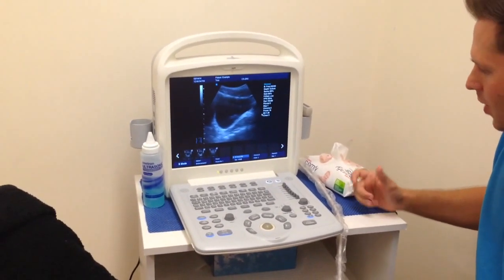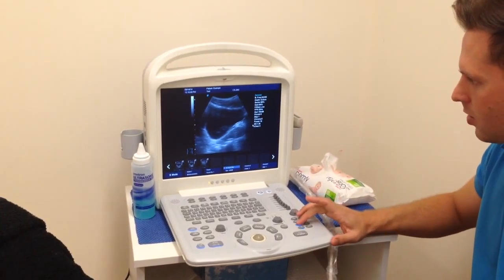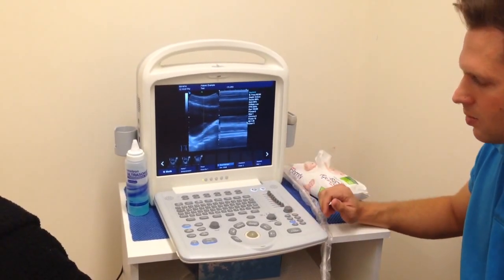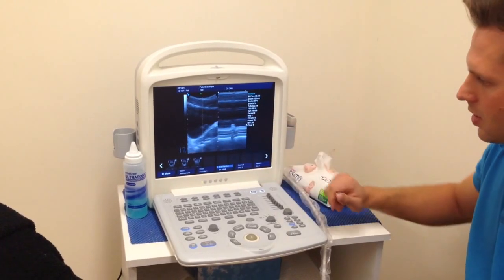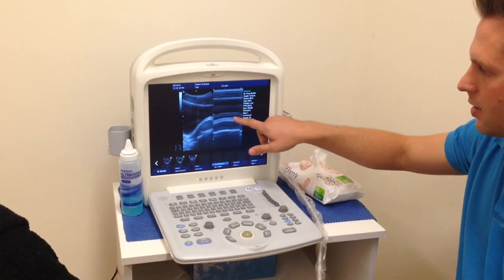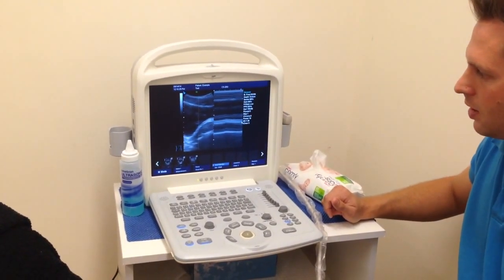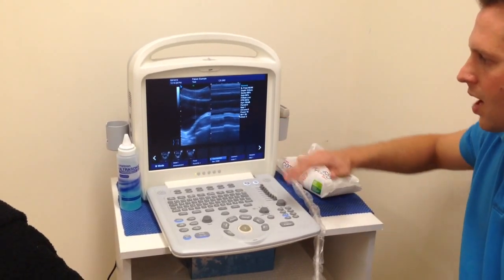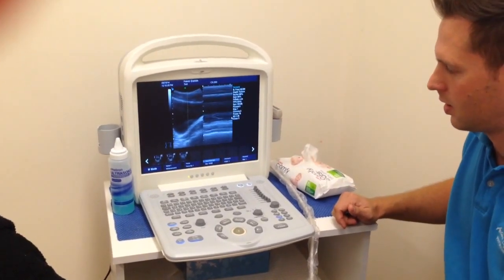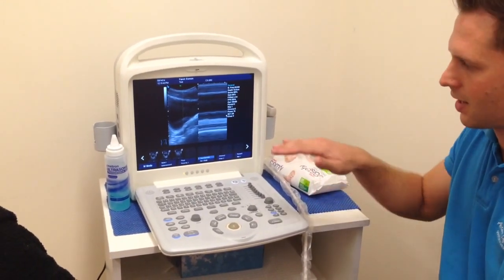The other thing you can do if you want to evaluate the quality of movement over time, and see if they're able to hold the muscle contraction, is to put it on BM mode. With BM mode, the left-hand side of the screen shows the image as it is, and this side shows the image over time. If you're able to just hold a contraction for a few seconds — we're looking at these lines and seeing how well Ben's able to keep them stable over time. Very good, apart from some small movements for breathing. And relax — you can see it drops off there. This can be very useful for determining the endurance or ability of these muscles to maintain that tone over time.